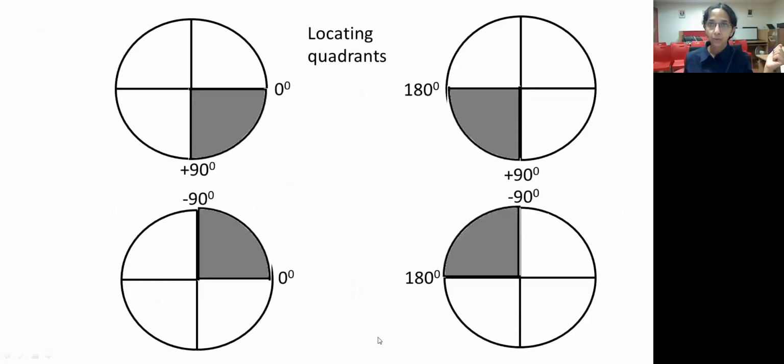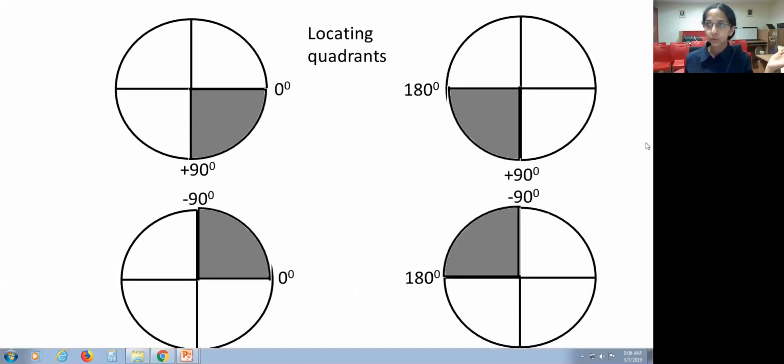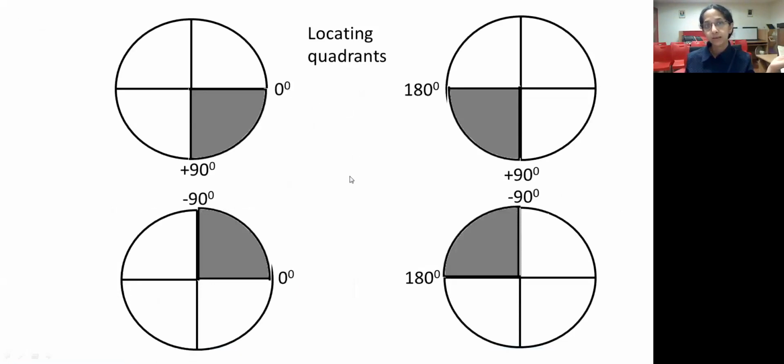So then how do I proceed? The easiest way first is to locate my quadrant of QRS complex. Quadrant means if I have my QRS in lead 1 positive and AVF also positive, then I know that my QRS axis will be in the left lower quadrant.